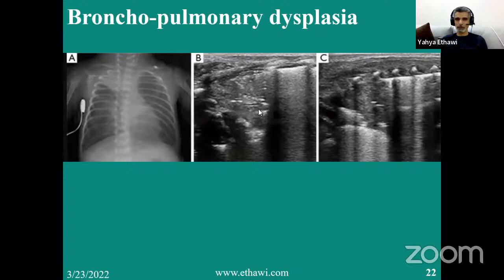Normal area, abnormal area. Even if it's abnormal, the B lines still go inside it. There is air bronchogram, loss of the pleura, C profile here. Here is more like grade 2 or even 3.